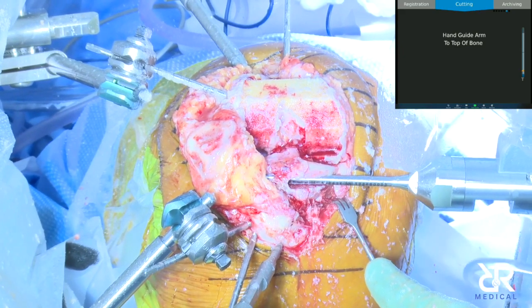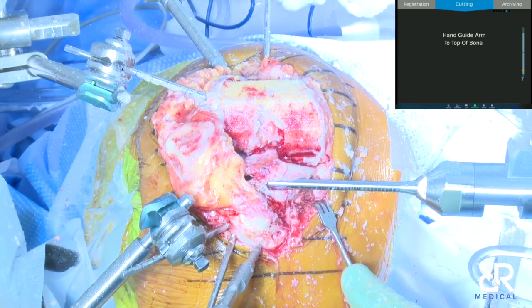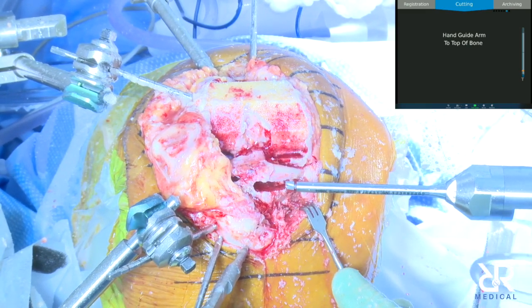Right, to the top of the bone. And you just have to plan it right. I mean, the only challenge about this technology is if you don't plan it right, you will have an issue.